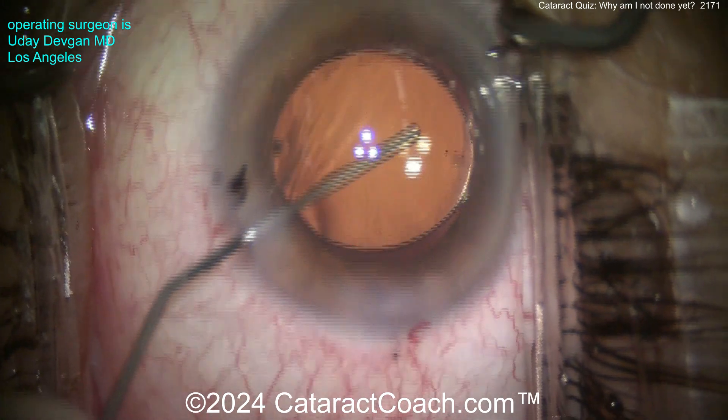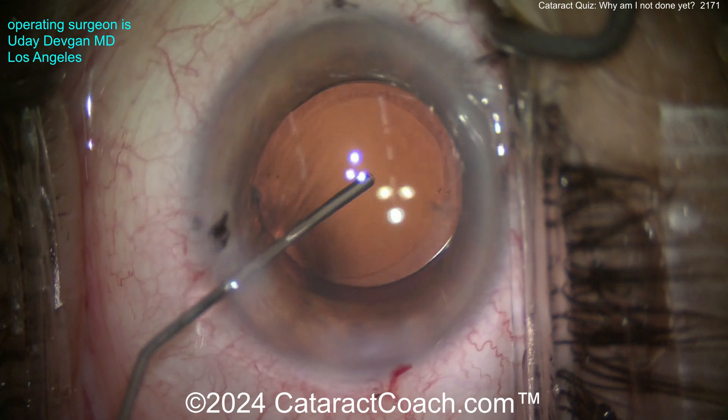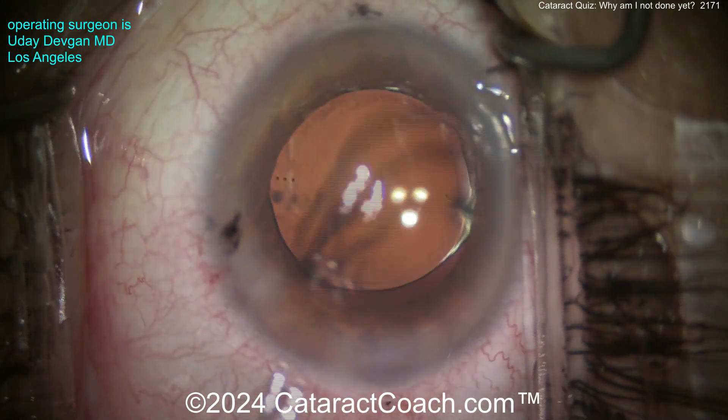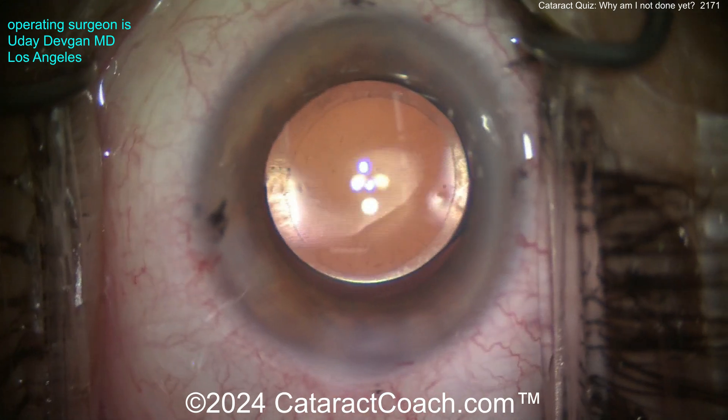Now the lens is lined up — I've got a nice-looking capsulorrhexis, lining up the lens where I want it, making sure it's in a really good position. I'm happy, but I still kind of notice something. Let's seal the incision — do you notice it yet?